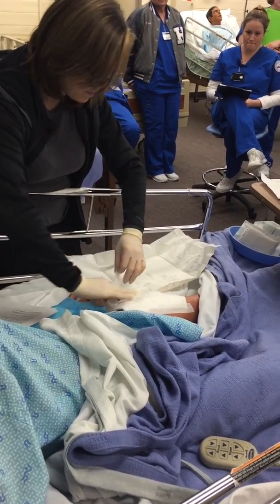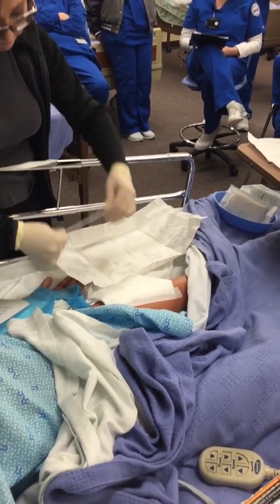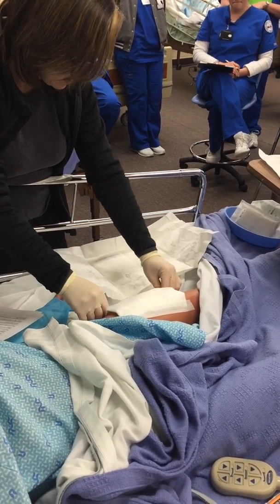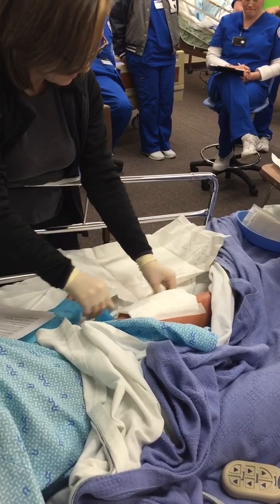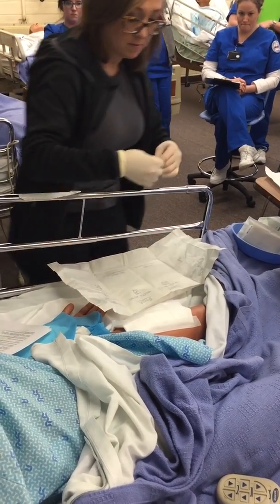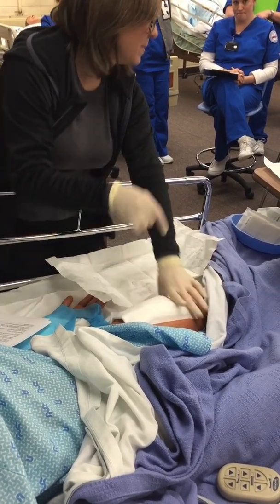So would you do the same thing if it was dry, just not with saline? You would. There's no saline. Okay. Except it's dry. That's coming out the bottom. You don't want that coming out. It wouldn't have them puckered up like she did though. Yeah. So you're just going to make sure all four edges are covered. That's the big thing on that.